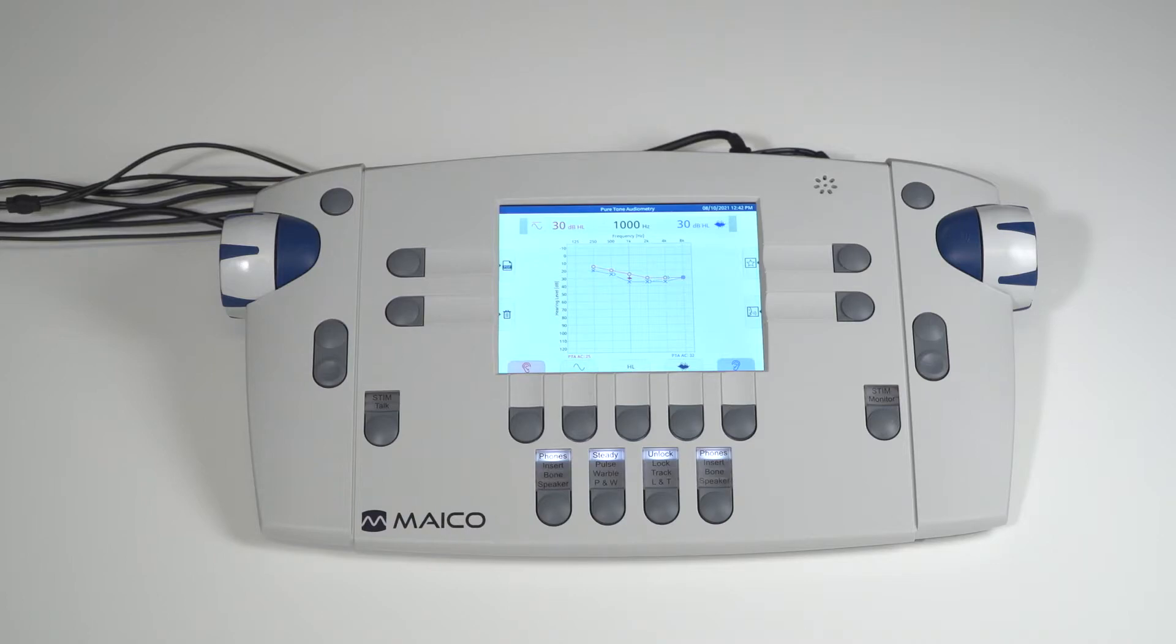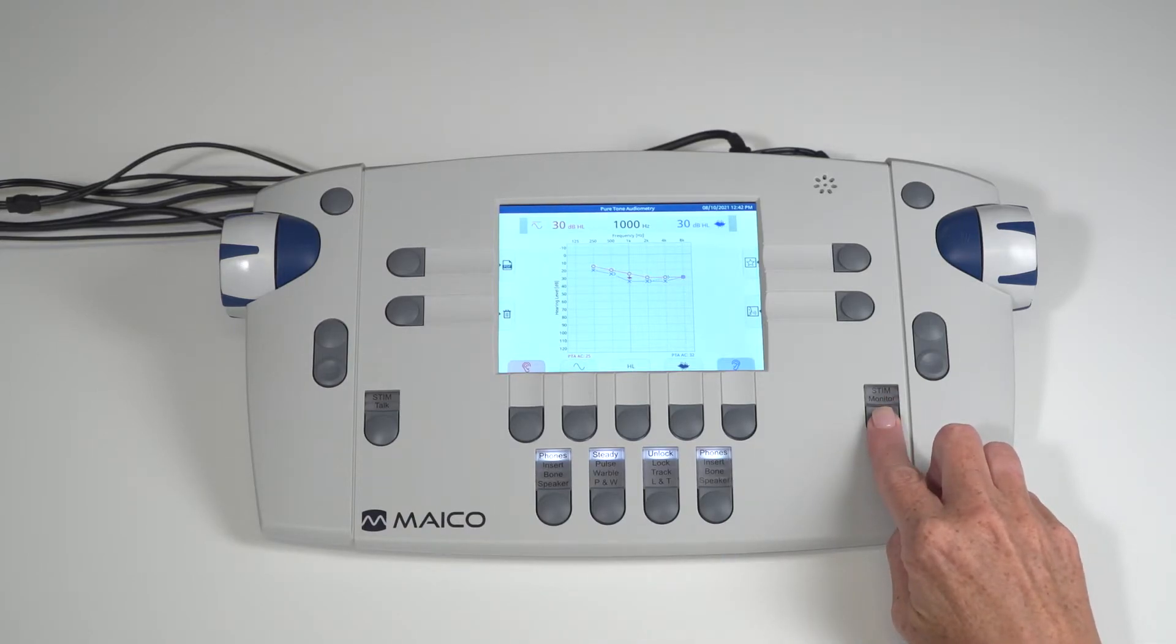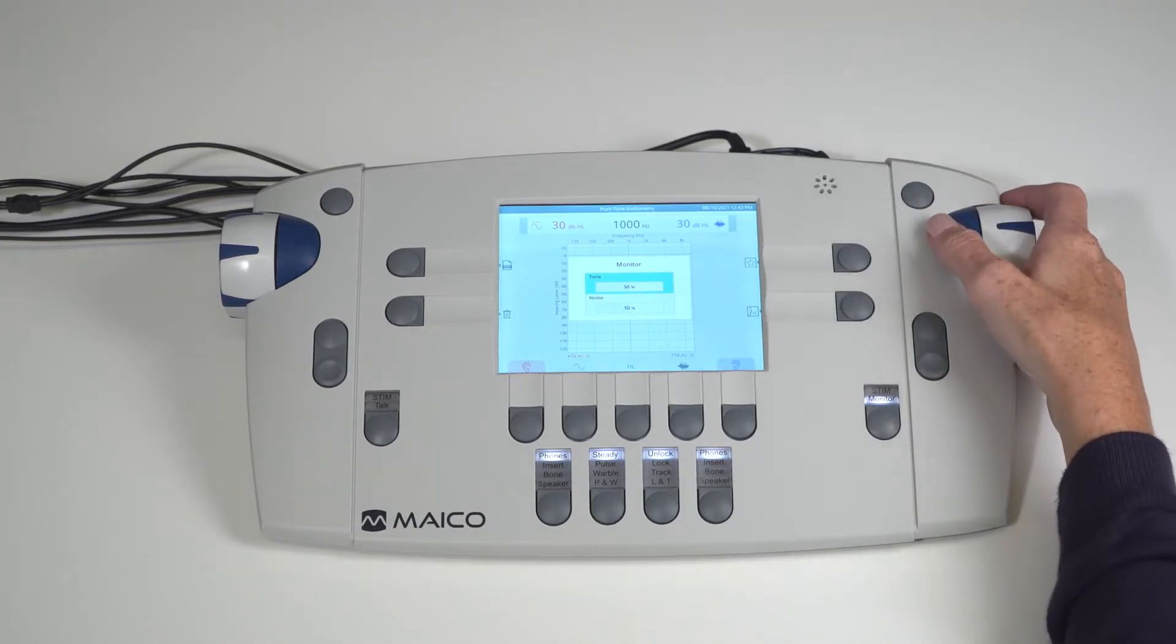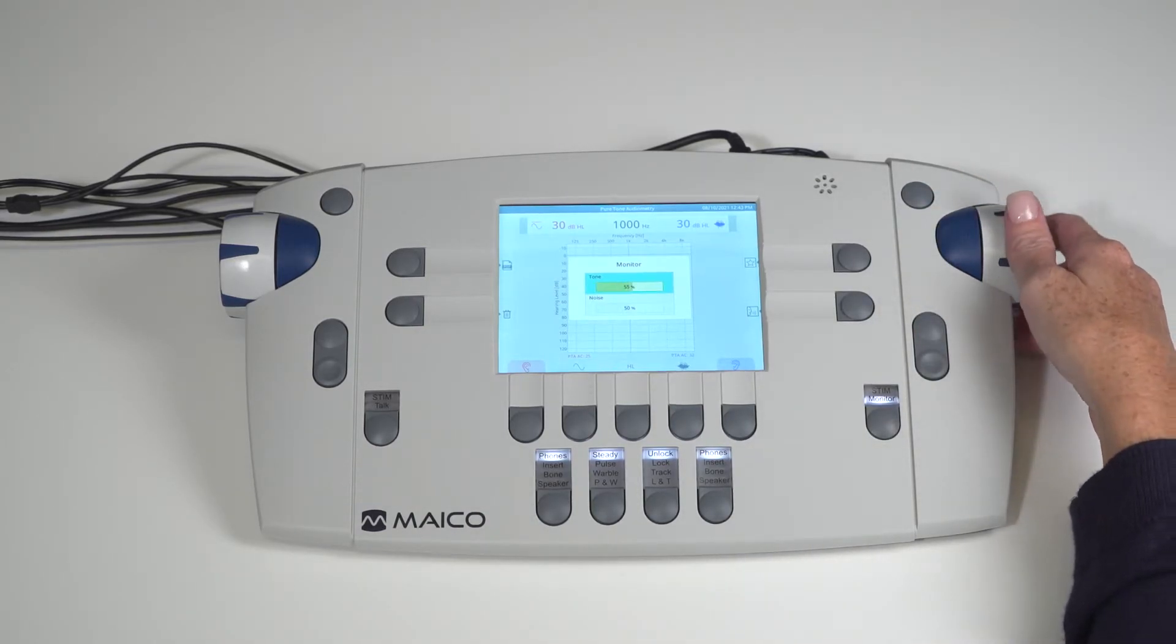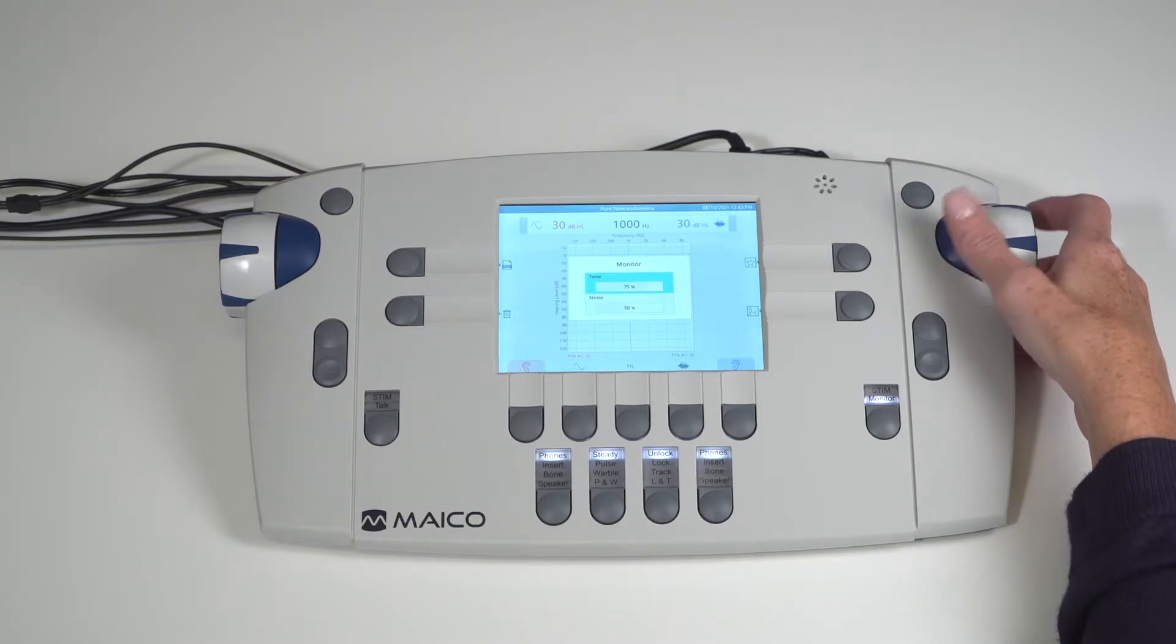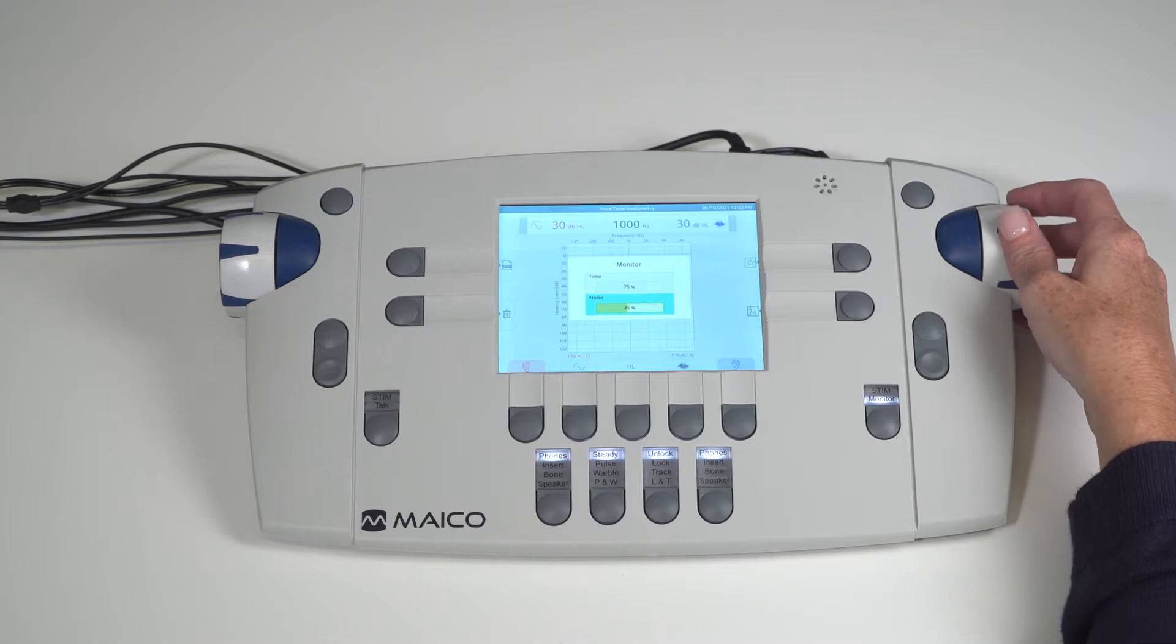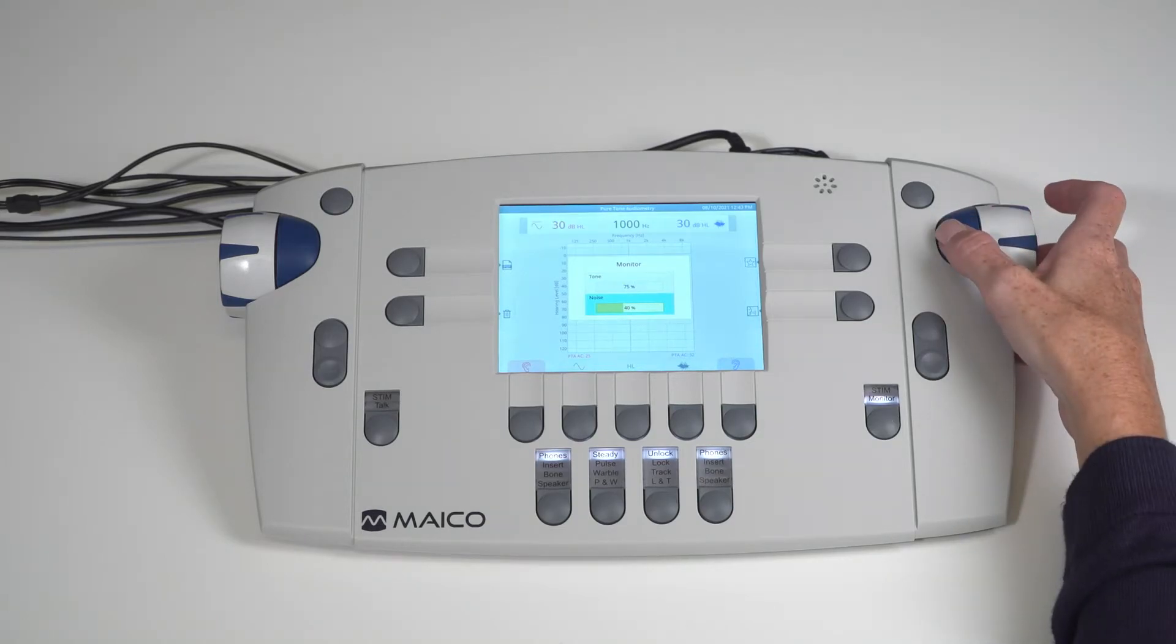While in the tone screen, select the monitor function with the right stim monitor key. Simply hold down this key until the monitor command shows on the screen. Here you can adjust the level of the monitor for tone and noise independently. Use the side dial to select which monitor type you want to adjust. When highlighted, press the blue present key. Use the side dial to change the setting. To exit the selection, press the blue present key again.